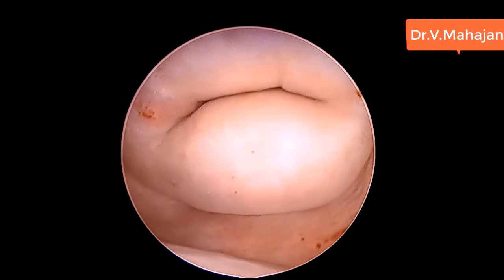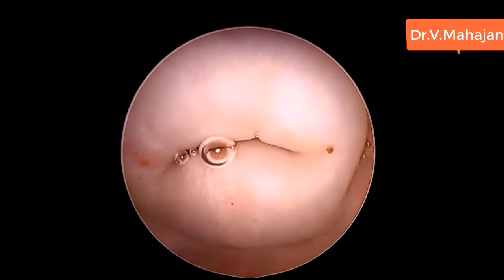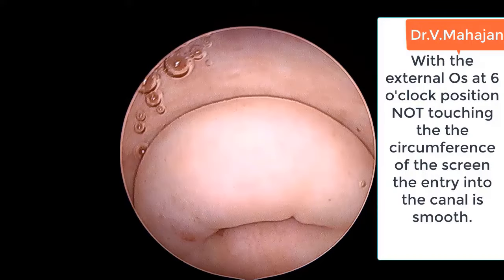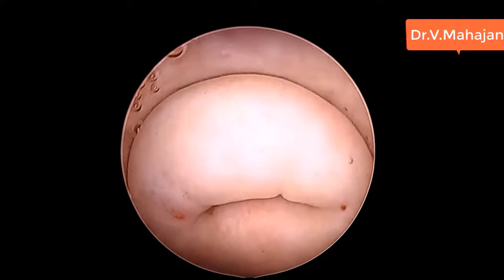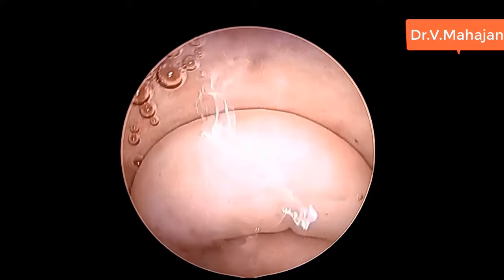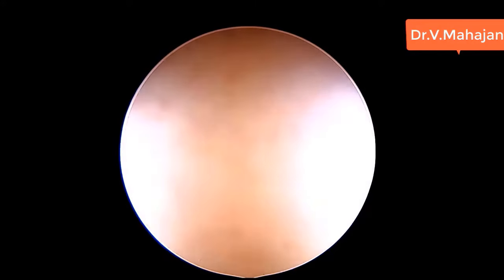It is not easy to enter when the external os is in the center of the screen. So if you want to have a smooth entry into the cervical canal, the external os should be at the 6 o'clock position, not touching the circumference of the screen, and you will invariably enter the cervical canal very smoothly.